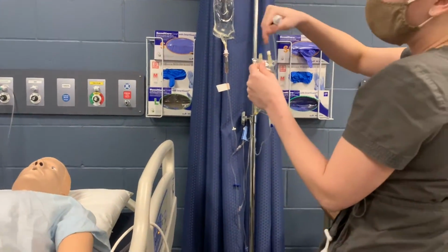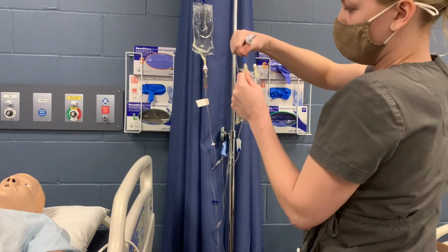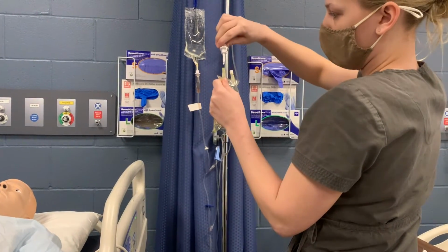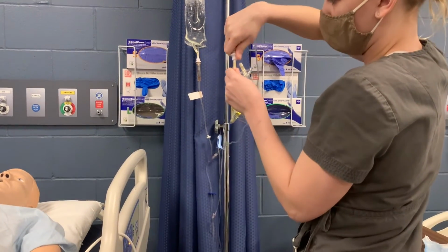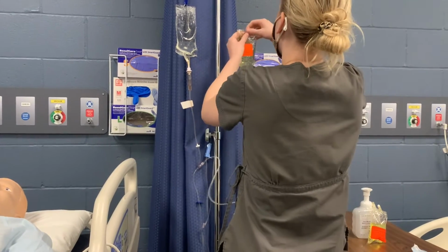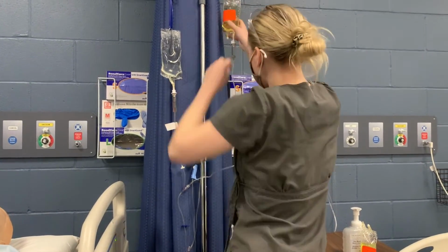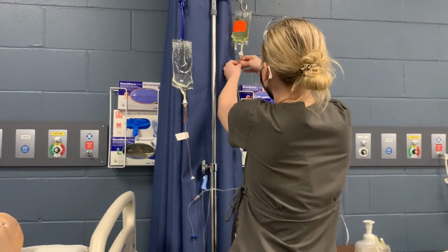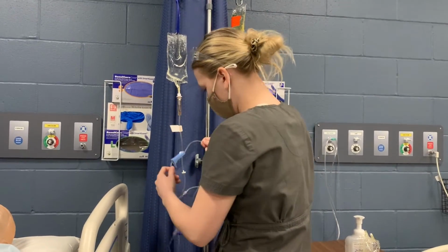Once I take this blue cap off, I want to make sure not to touch that port at all. Cap will come off. There we go. Throw that out. I can go ahead and spike my IV bag here, just like that. Okay. Now I'm going to go ahead and invert it on here, just like that. Fill up my drip chamber a little bit. Perfect. And then I can go ahead and connect my tubing.